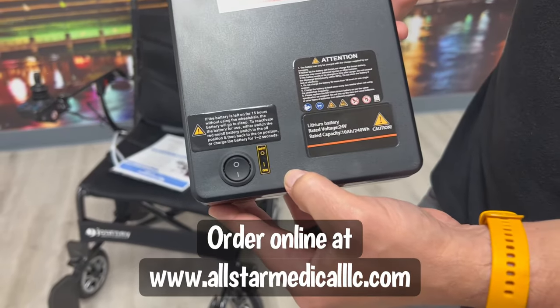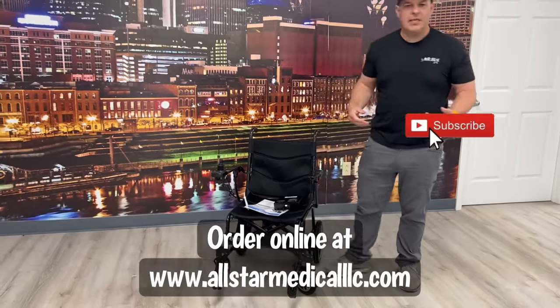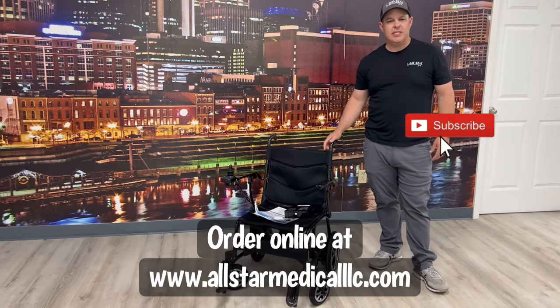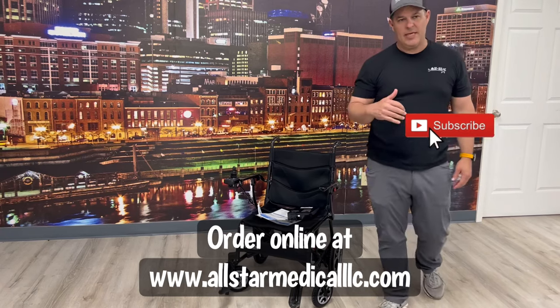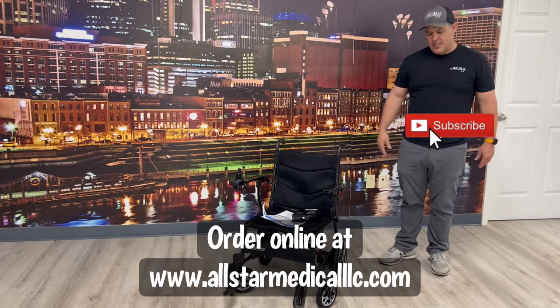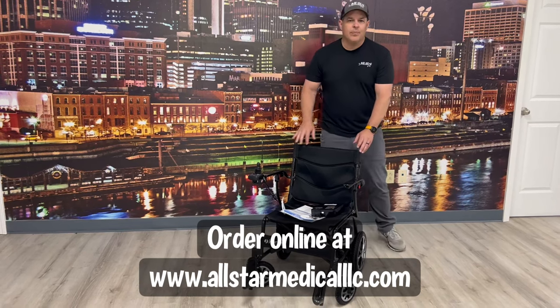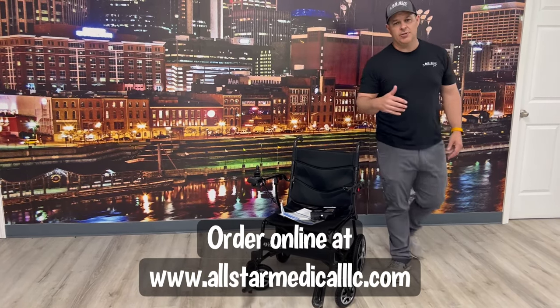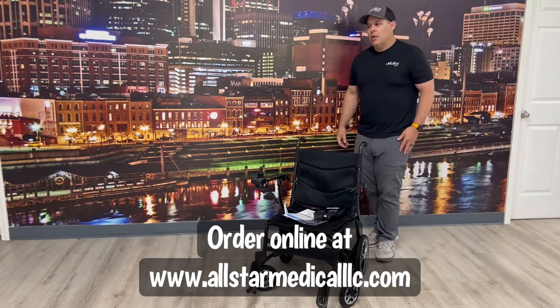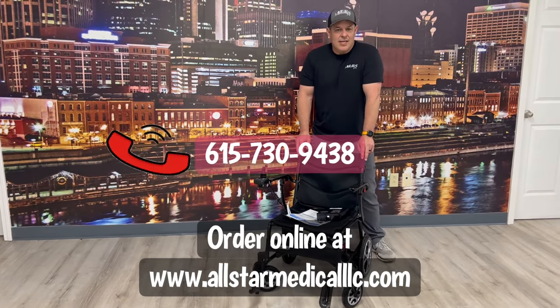Journey has done a really good job with this chair when it comes to portability. I don't know of anything on the market right now that's anywhere close to it. Just remember that 240-pound weight capacity — make sure that fits your needs. Other than that, it's extremely lightweight and drives really well. This is available from us here at All-Star Medical.